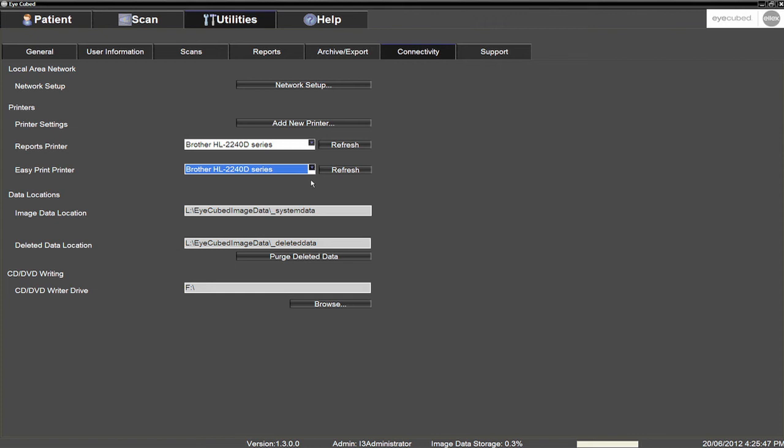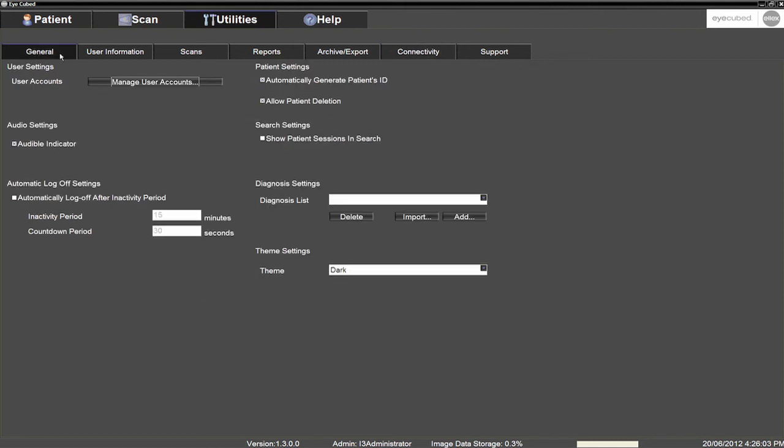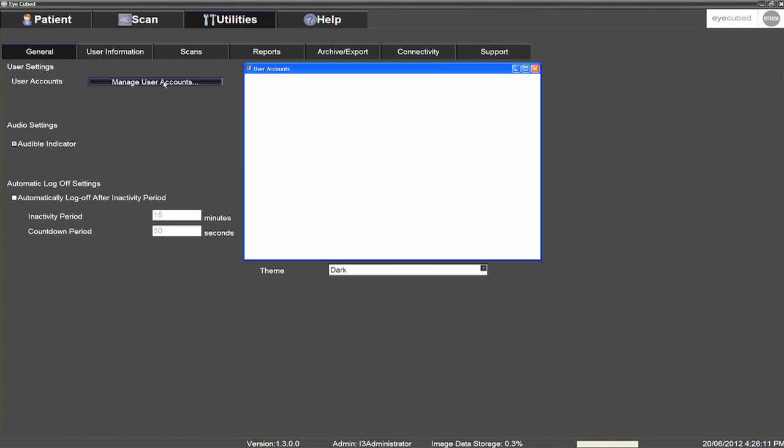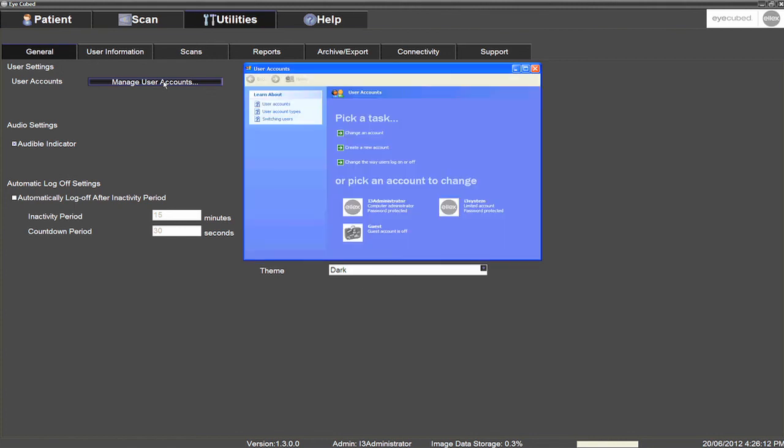For daily clinical use, particularly in larger institutions with multiple users, LX recommends creating one or more limited accounts without access to administrator functions. To create a new user account, click the General sub-tab in the Utilities section, which is the first option on the left-hand side of the screen. Select Manage User Accounts and then Create a New Account.